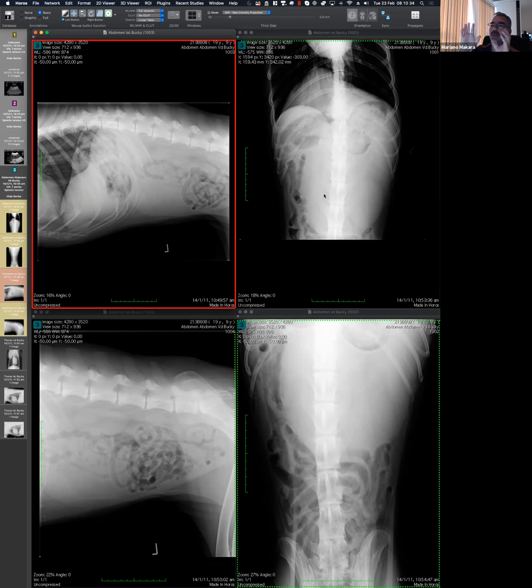If instead of saying mass effect, we use the word mass, then your argument is perfect. Well, if we see contours, then that's a mass. We don't expect to see contours if there is free fluid. Any other argument? Yeah, makes sense. That explanation, that was quite long and complex, is clear enough. Any other argument in favor or against, whatever?